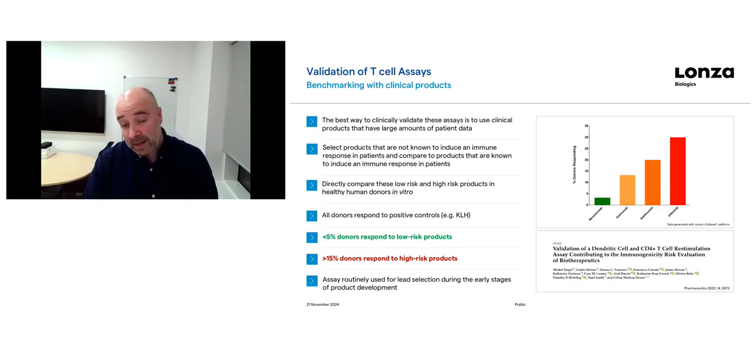And there's also some independent validation of this assay platform. So there was a publication from a few years back from the Roche group. They've done a lot of screening in our assay, and they were really nice enough to do an independent validation on all of our raw data and all of the different controls they've included, and that's really nicely outlined in the paper. But the pros and cons of these assays, where the sources of variability are, what the accuracy is. I think it was typically around about 80–85% correlation with the clinic, which we were pretty happy with. And there's a few examples of how they in particular use it in their pipeline screening. So that's a really nice paper to look for an independent validation of these sorts of assays.